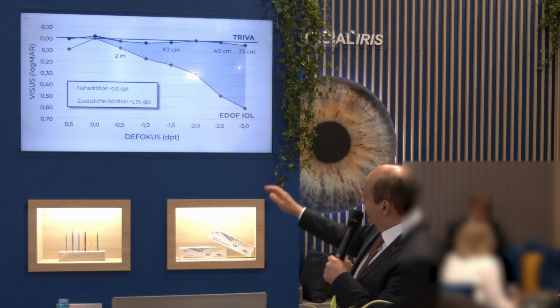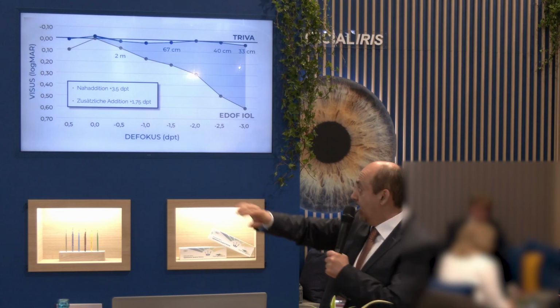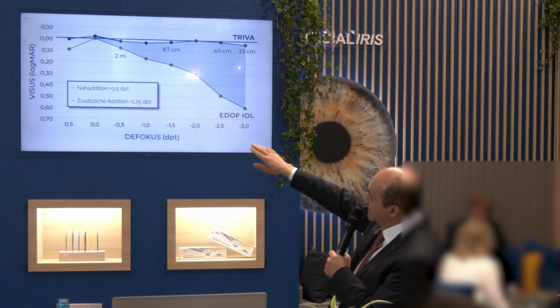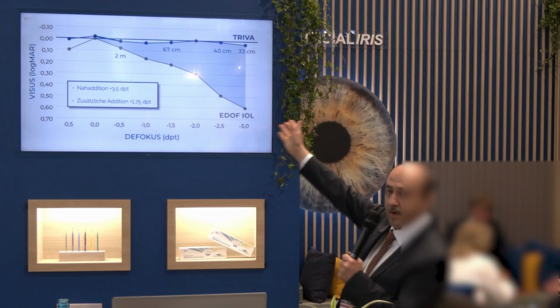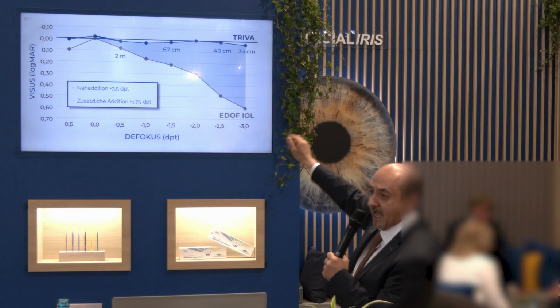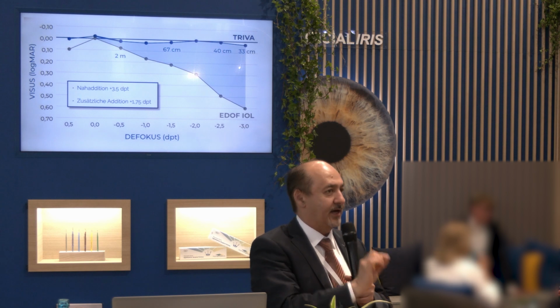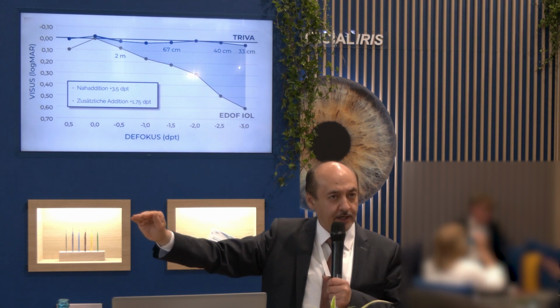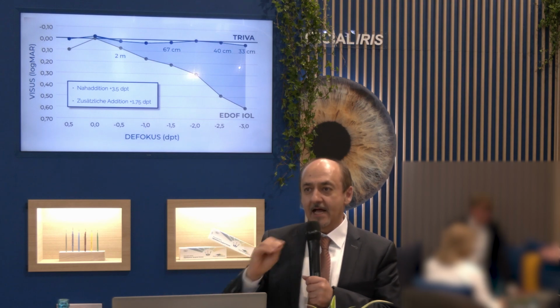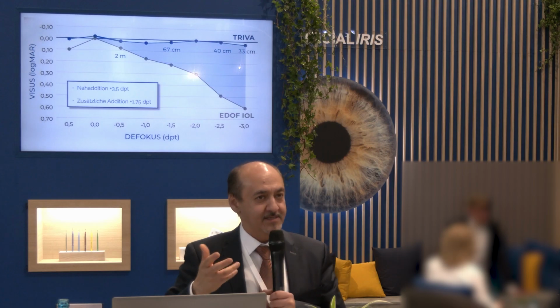But you can improve this a bit by elevating the whole thing through this combination of refractive and diffractive optics. That means you are then at a logMAR visual acuity of 0.1, so you're actually at 0.8 to 1.0 up there. Yes, that's the range that you can draw isofocally, i.e. equally strong, isofocal up to 33 centimeters. And that explains why this class of lenses is called continuous vision, i.e. seamless progressive lenses, if you will. This is a classic progressive lens, if you will.